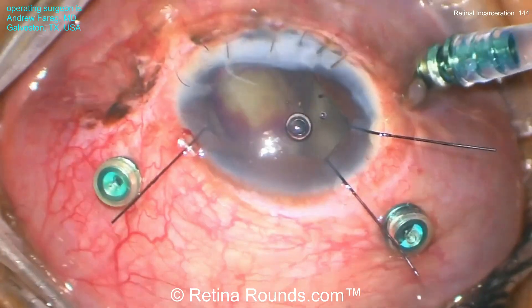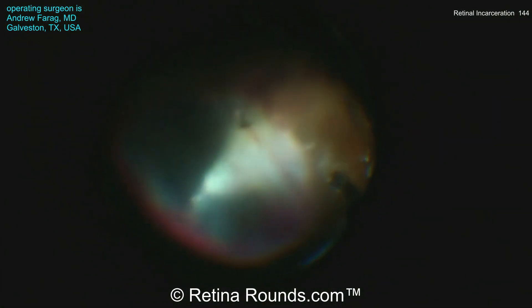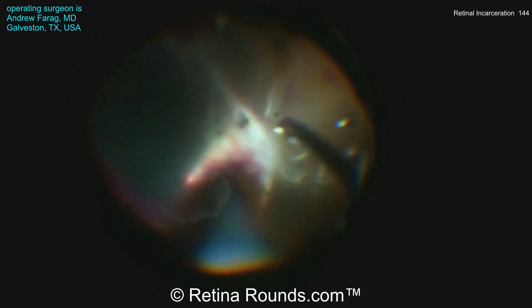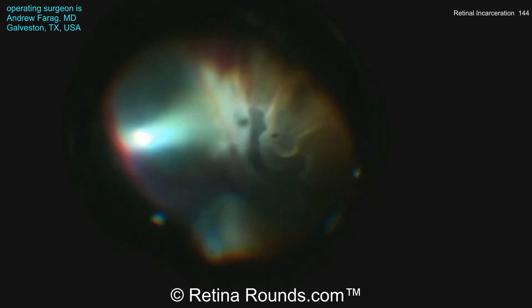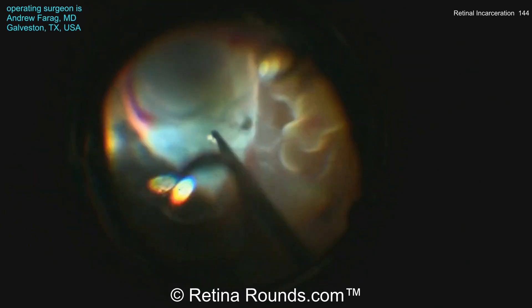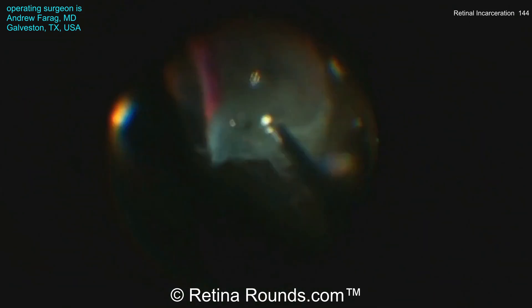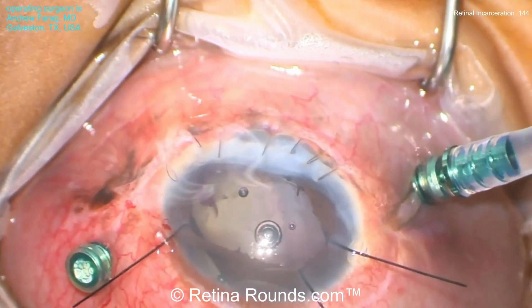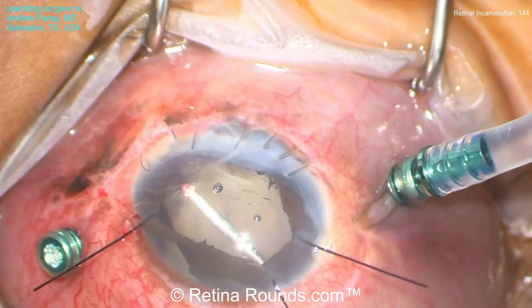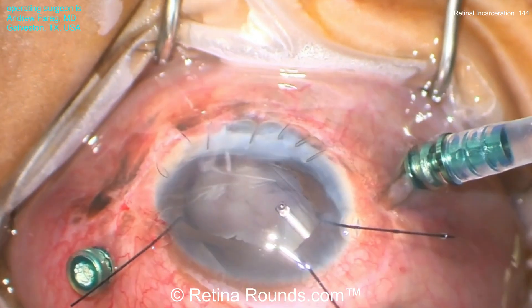Two additional trocars are placed and a lensectomy is performed. Using posterior segment visualization and the vitreous cutter, some vitreous is removed and the lens is engaged. This is a young patient, so the lens is much softer and can typically be removed with the vitreous cutter. As he cuts the lens and removes vitreous adhesions, it becomes more mobile and appears to drop down to the posterior segment. He then removes air bubbles against the corneal endothelium that are interfering with his view.